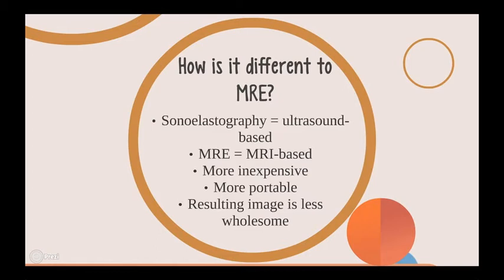In comparison, sonoelastography uses ultrasound-based shear waves, while MRE is MRI-based and uses low-frequency waves. Sonoelastography techniques are relatively inexpensive, portable, and increasingly available compared to MRE. However, MRE provides a more wholesome image compared to sonoelastography as it only images a small portion of the tissue.